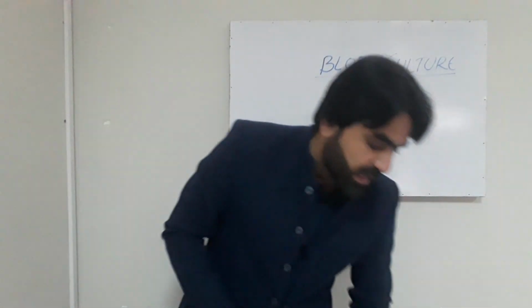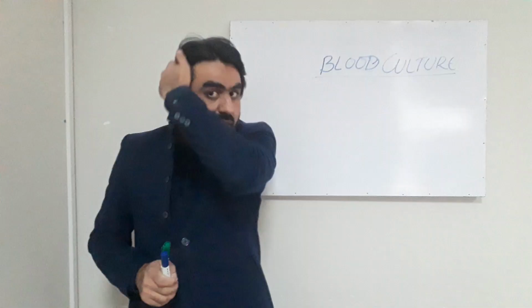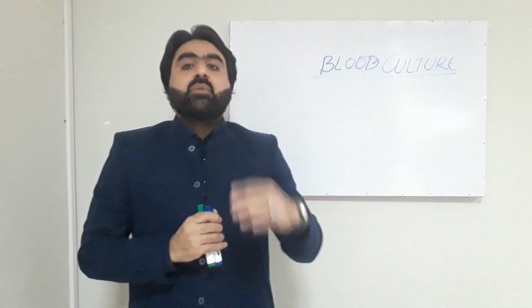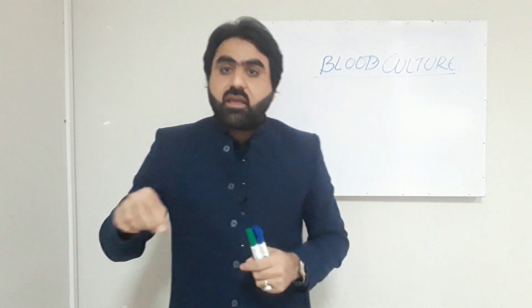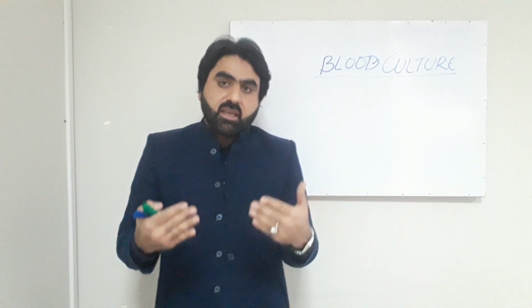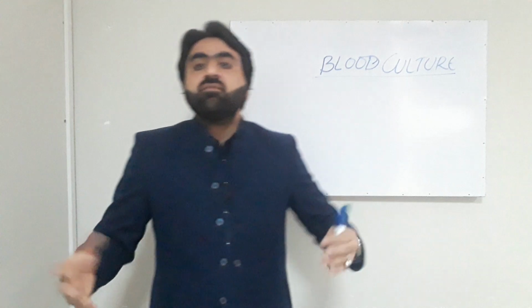Another question is: if we get any growth in a blood culture, is it a true pathogen or could it be a contaminant? The interpretation of blood culture is very important, because blood is sterile, but we can introduce contaminants during collection of blood. Therefore, whenever you get growth in a blood culture, you need to carefully interpret whether the growth is a contaminant or a true pathogen.